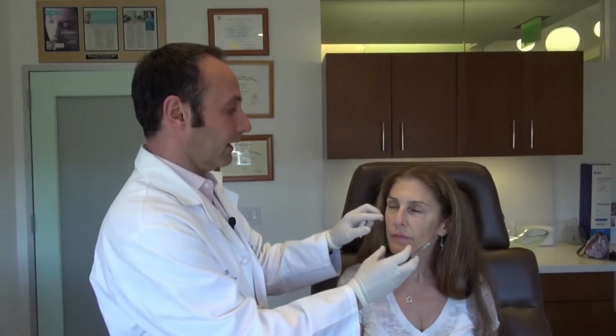Especially when she gets tired, she gets these dark circles underneath her eyes, and she notices that over time she's had some volume loss in the area, and she has an indentation in that area. So what we want to do is fill that volume loss, replace that lost volume, and blend the contour of her cheek into that of her lower lid.